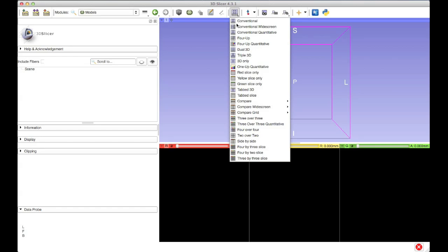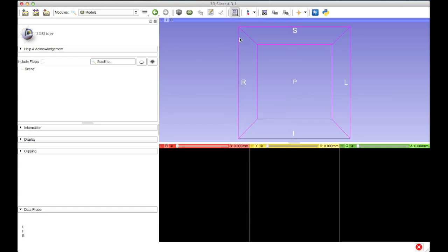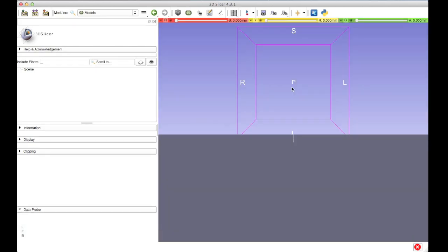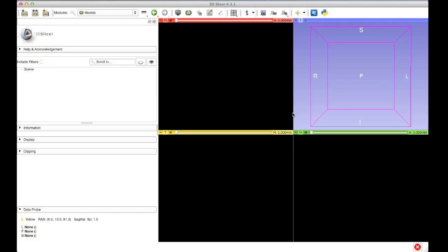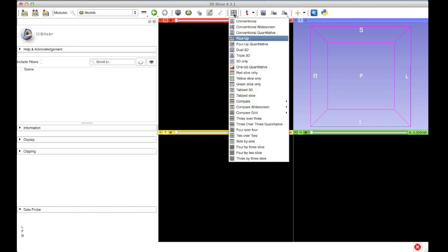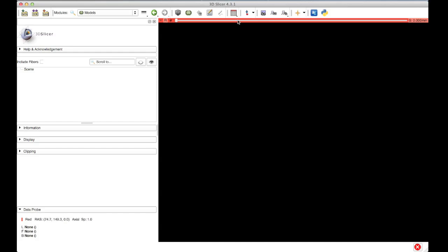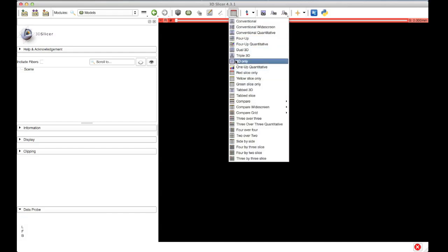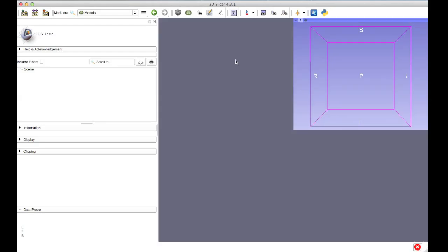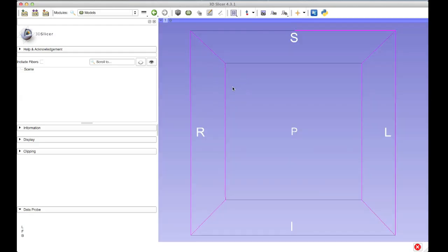Depending on what you're doing, you'll use different layout options. The 4Up allows you to see all four panels adjacent to one another. If you choose to, you can view only one slice — for instance, red slice only. And if you need to, you can also choose to view the 3D only. So if you're doing an analysis that requires that, you have that option as well.